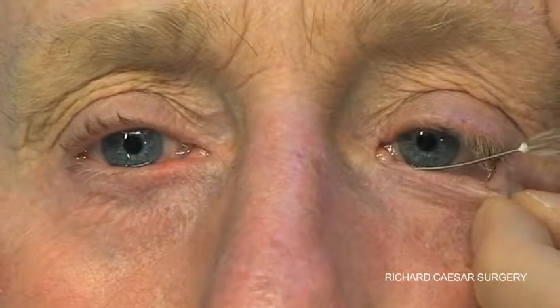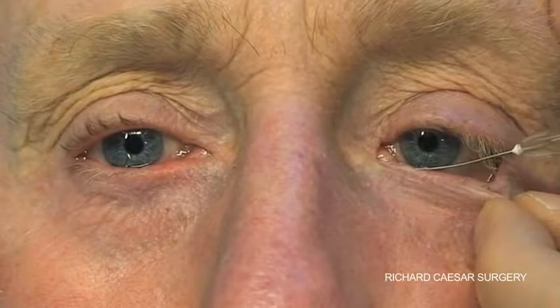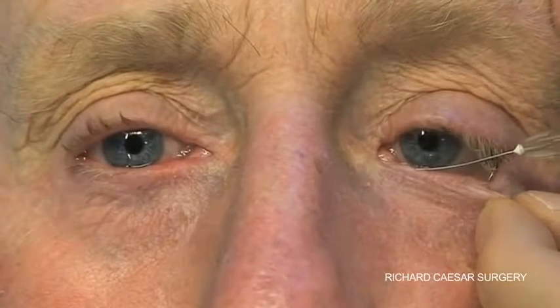If the lacrimal cannula cannot pass through the punctum, then there is punctal stenosis by definition.